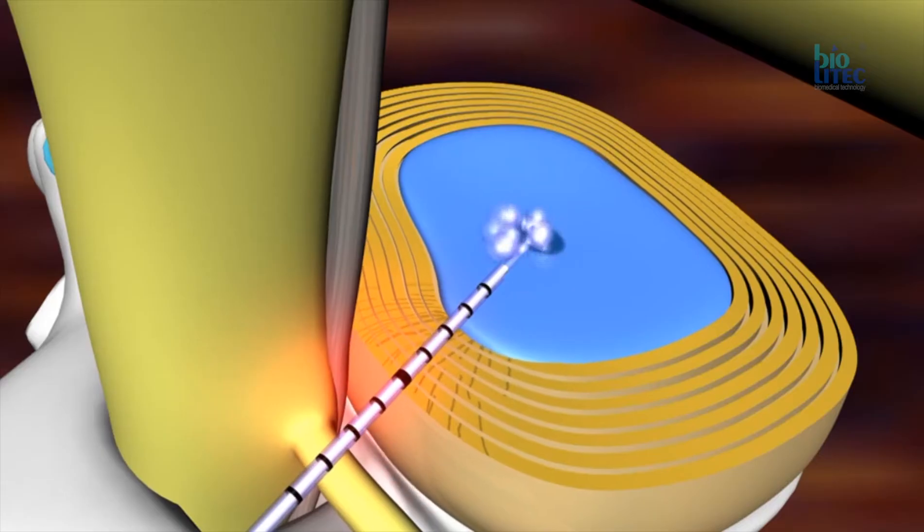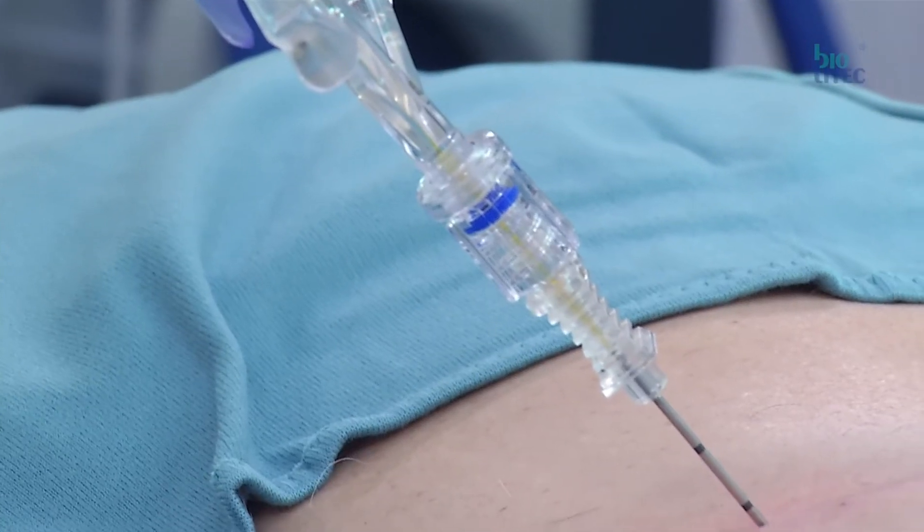The precise application of laser energy into the nucleus pulposus of a discus reduces intradiscal pressure, leading to a reduction of nerve root compression. The laser heat also achieves a thermal destruction of intradiscal nociceptors, which are often responsible for a discogenic pain syndrome.